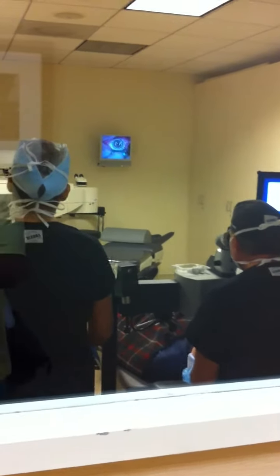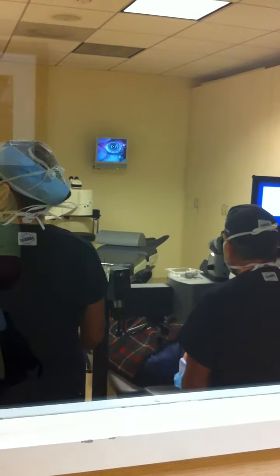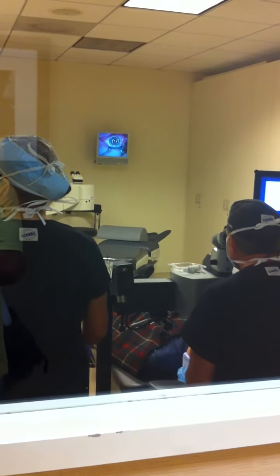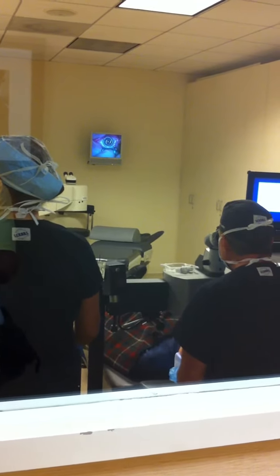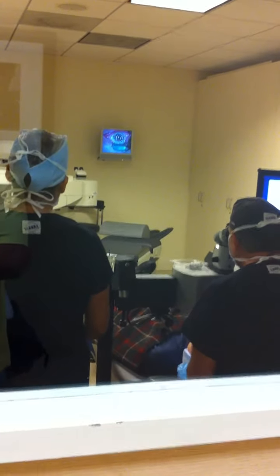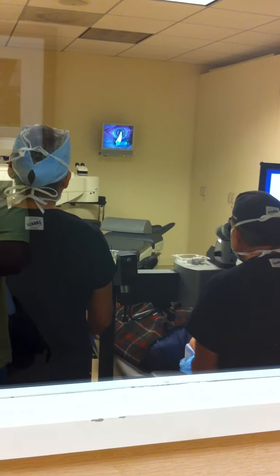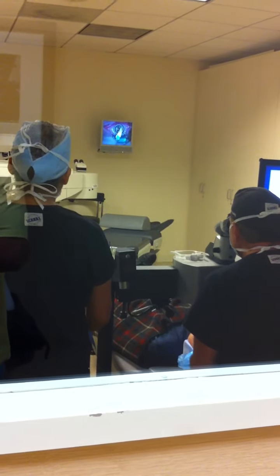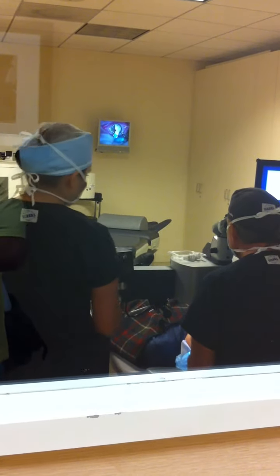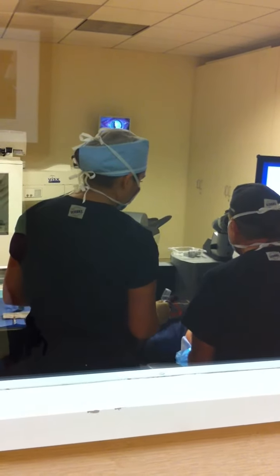You want me to narrate? Narrate. Yes, you can narrate. Right now, we're holding 10% alcohol on the cornea to loosen the epithelium so he can scrape it off later and let the laser take care of the rest. Sweet. That's the kind of narration we need. You can just see little things happening back there. It's a soft sponge, but it'll do the trick.